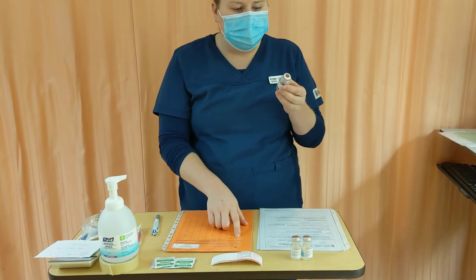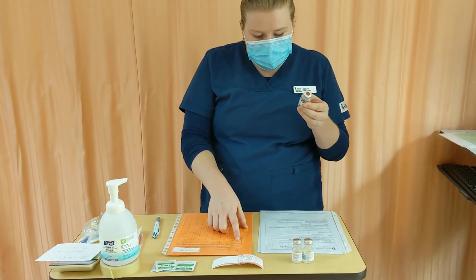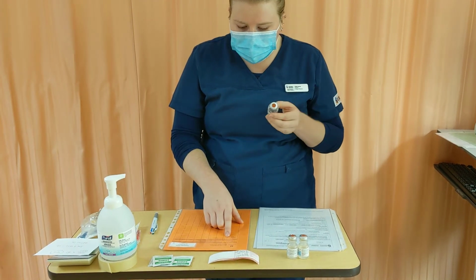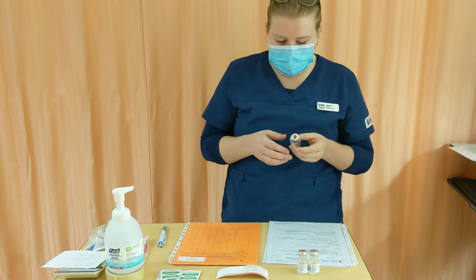So this is a 1 gram vial. I'm going to be reconstituting this with 20 mLs of sterile water for injection. So I'm going to need to draw up 10 mLs of the solution to get my 500 milligram dose, so that's correct. IV, this can be given IV, it says for intravenous use only, so that's correct. Q12H, it hasn't been given yet at the correct time today. It's written twice. I can go ahead and give this medication now.